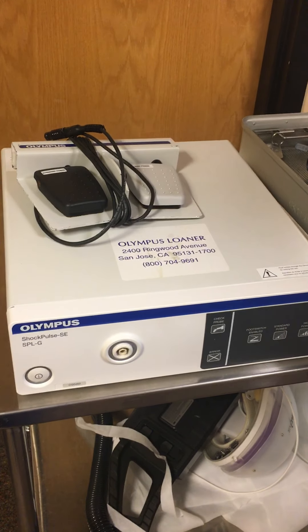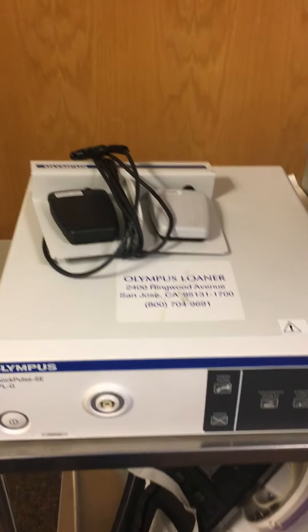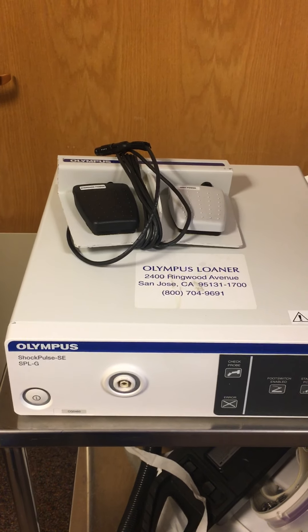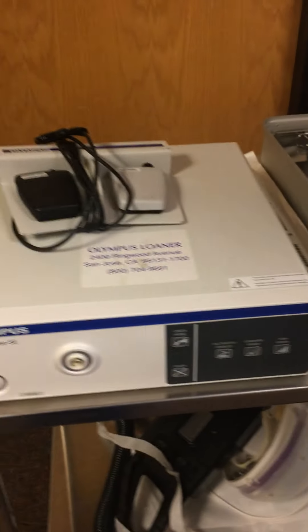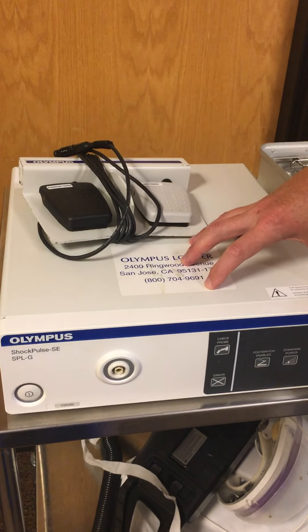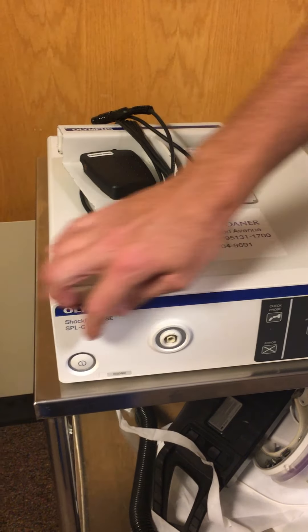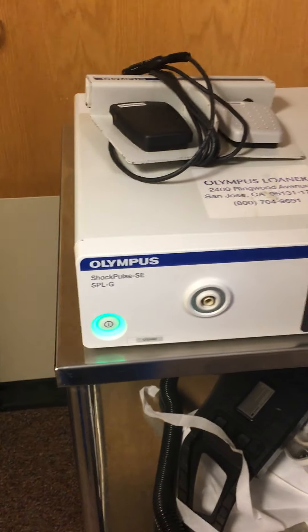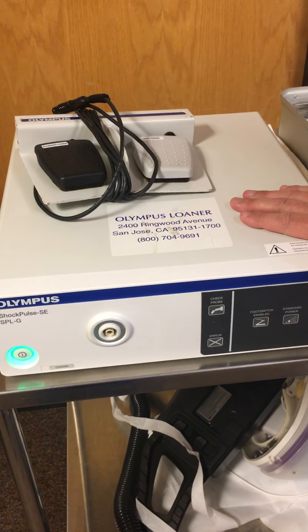Hi, this is John Palmer, Olympus Urology Rep, and we're going to go over our ShockPulse PCNL system and ShockPulse tray used for percutaneous nephrolithotomies. This here is the actual ShockPulse generator — it's a plug-and-play generator. The power cord is in the back, and the power button is on the front left. When you turn it on, it's ready to go.